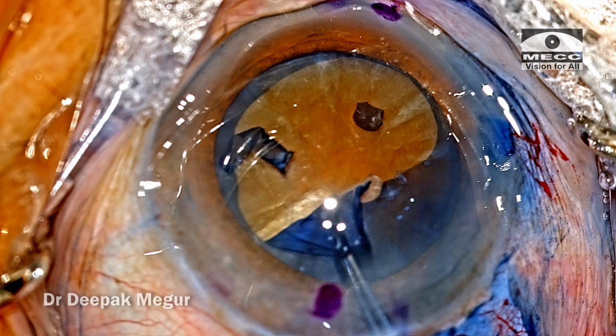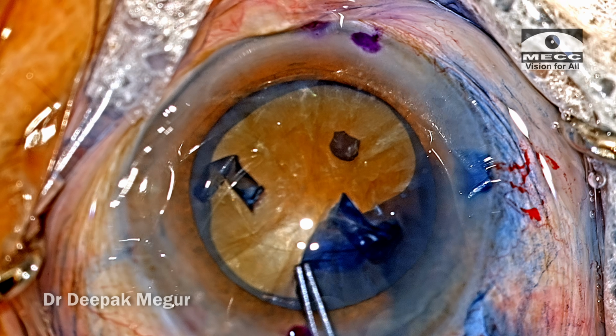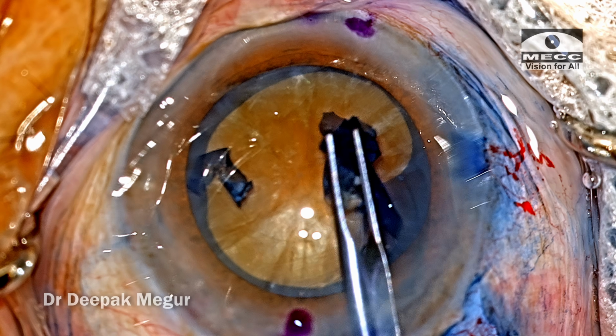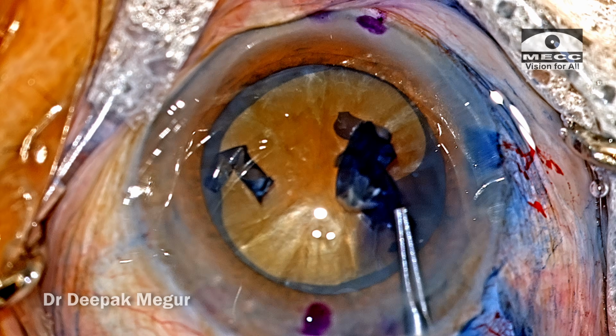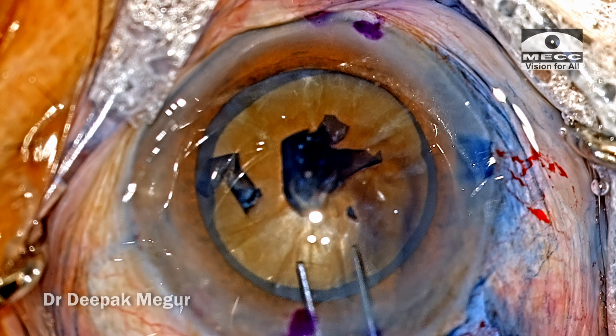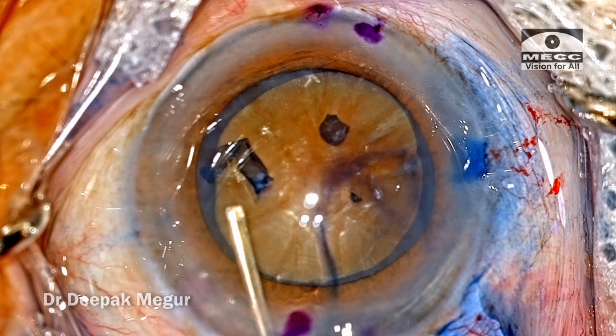Ideally, if you're planning a toric lens, the rhexis has to be around 5 mm, but this is a special situation where I don't want to compromise or sacrifice any zonules of the capsular bag. So I want to preserve the bag first, so that at least I can put the lens inside. So rhexis is done. Time to perform the hydrodissection.